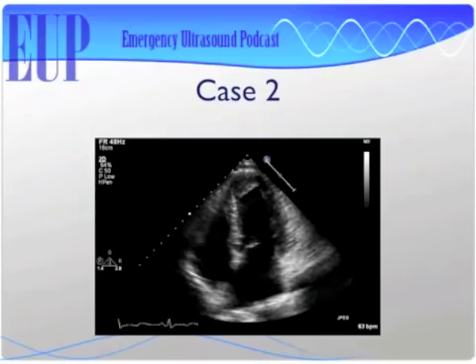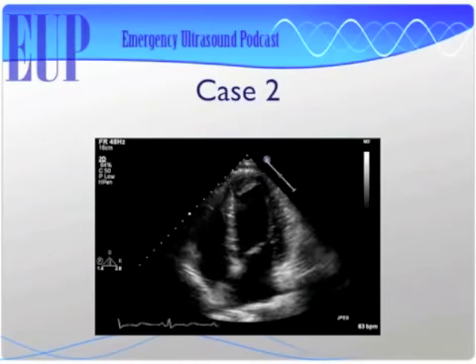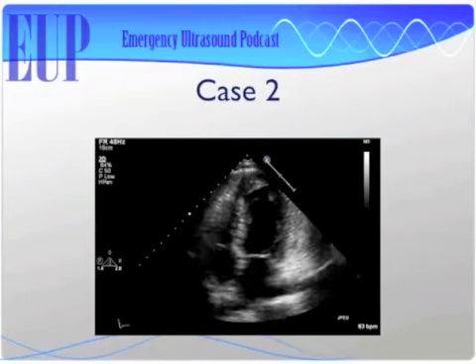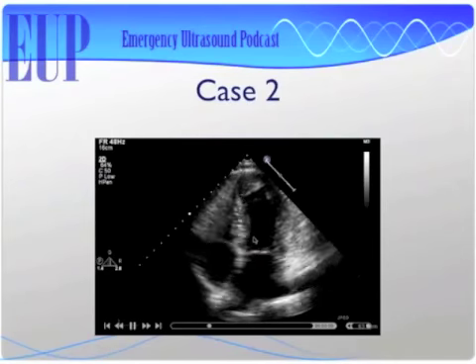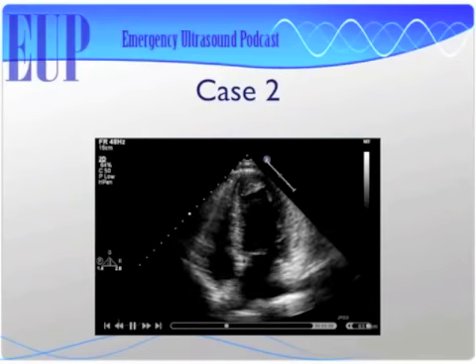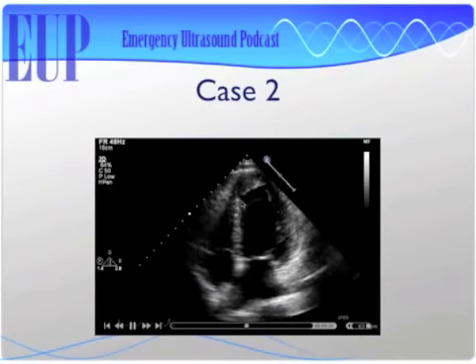It doesn't look horrible. The left ventricle is squeezing, but not all of it is squeezing. It looks to me like the apex is not working. Okay, so what you're saying is this mitral valve is opening really well and almost abutting that septum, telling me that the actual ejection fraction is probably decent, but something's weird, huh? Apex is lazy. Something's weird.